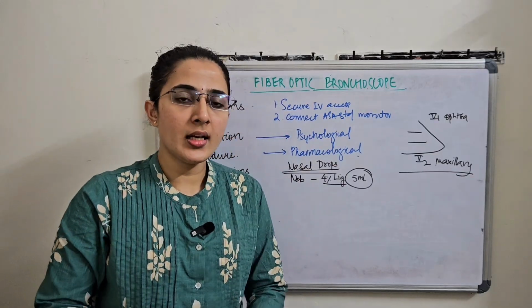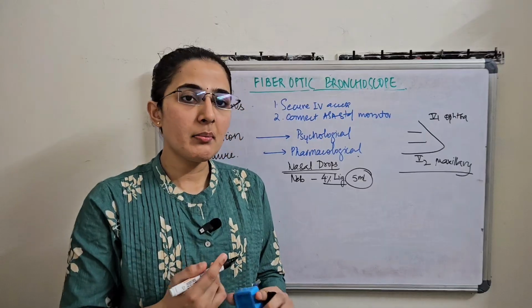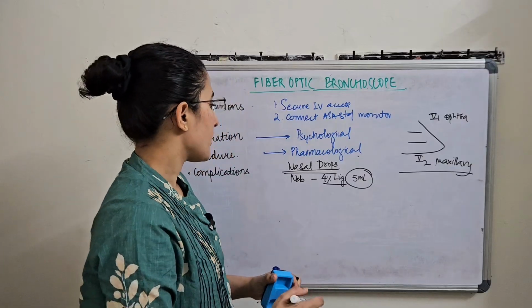Another way, if we are doing an oral fiber optic intubation, remember to always use an oral airway, preferably like a Berman airway or Ovassapian airway.